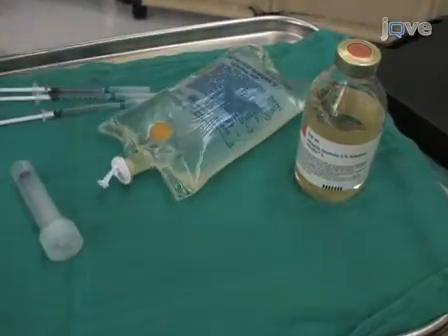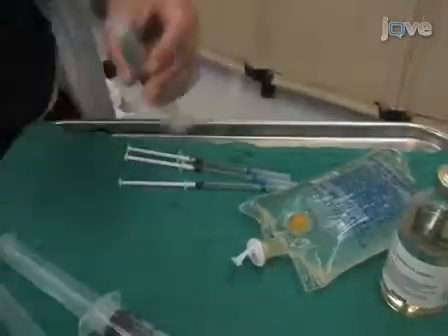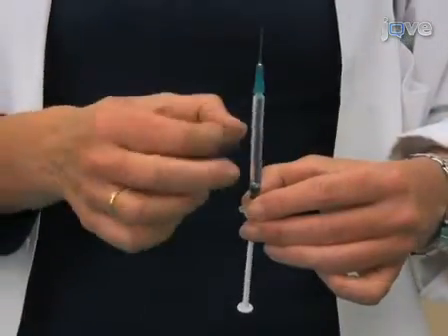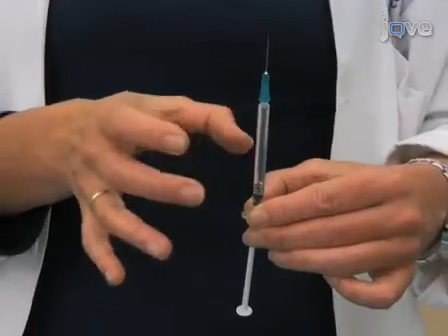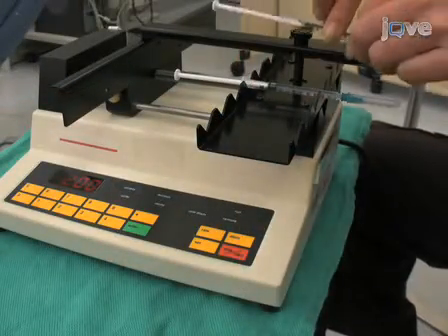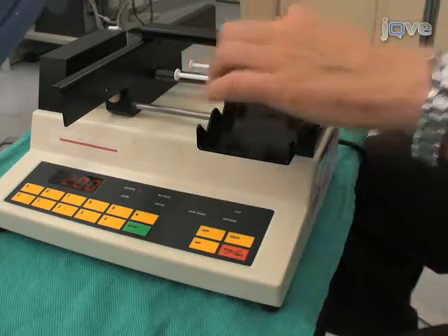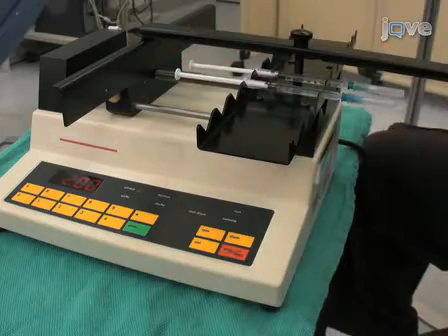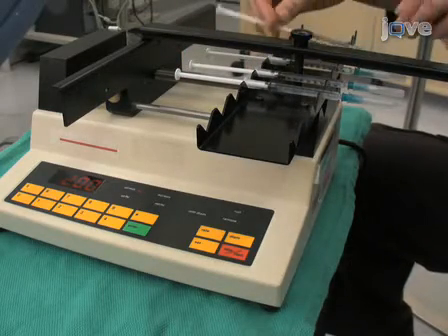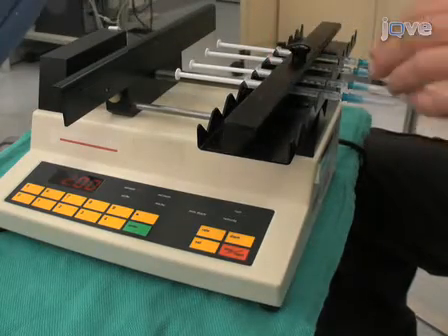Prepare a 1% human albumin solution in lactated Ringer's solution and draw it into the 1 cc Luer tip syringe, making sure there are no air bubbles remaining in the syringe. Load the syringe with the 1% human albumin-enriched Ringer's lactate solution into the cradle mounted onto a high-precision infusion pump. Multiple syringes can be loaded to simultaneously obtain interstitial fluid samples from various sites.